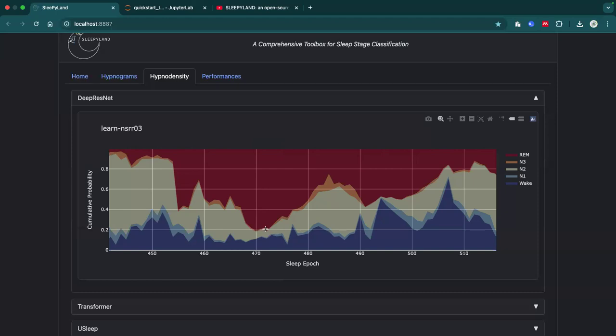This kind of representation is much more powerful, because you may notice that it's not only about REM and awake, it's not 0 or 1, but a continuous process. From not REM, I'm moving to N2 and so on, awake and so on.